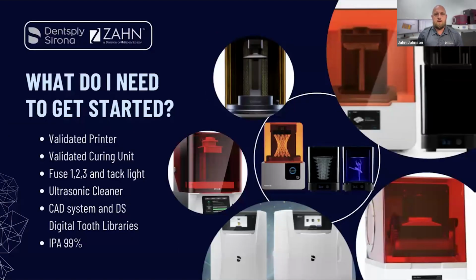What you need to get started is kind of the big undertaking. You've got to have the right CAD system that fits you, your computing system, cleaning equipment, the printers, and then you've got to have the training. Once you get through that part, you will be very excited. I am an Asiga user, just to be transparent. Right now, Carbon and Asigas are validated, and I hear mumblings that a few more printers will be validated in the near future, which is very exciting. It will make the market more competitive and more accessible to all of us.